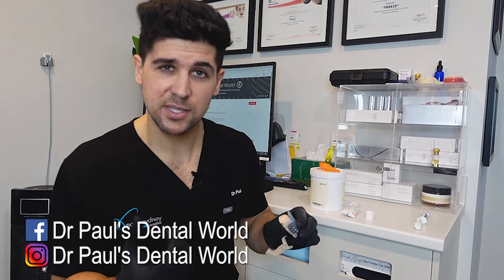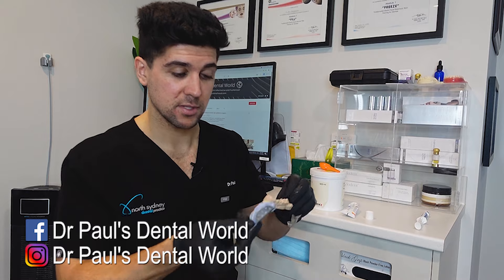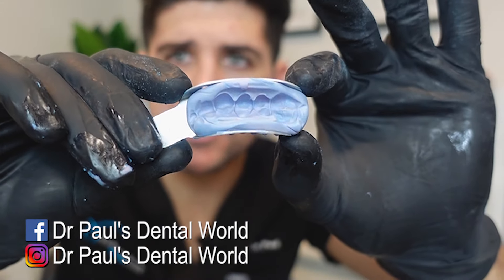Now I'll always test by putting some finger pressure on just to see how firm it is. Sometimes I'll put my nail in to see if it actually digs in or not. If it doesn't, it's ready to come off. So then we'll take it off. This is how that's looking — captures the detail really, really well.